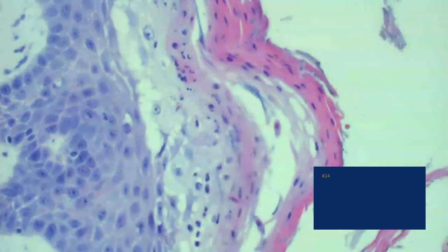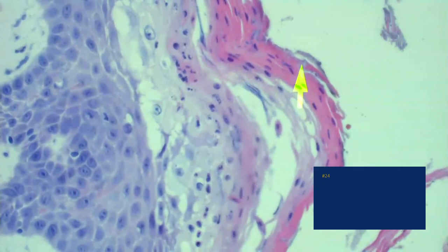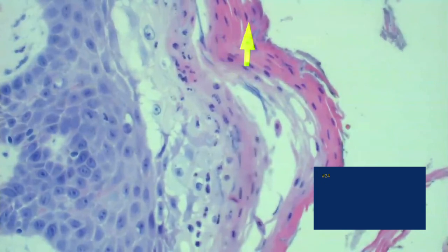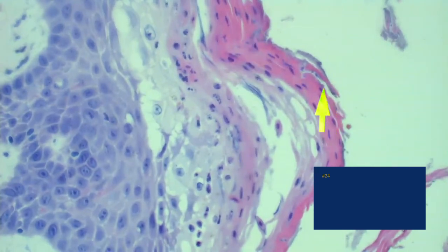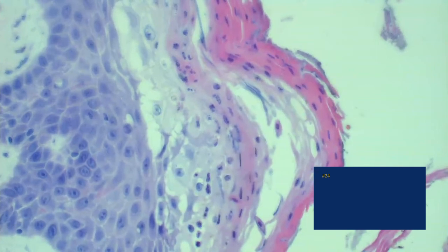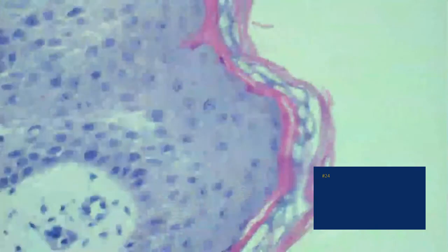So I thought about the sandwich sign as well. I wanted to make sure that there wasn't tinea anywhere. Looks like there actually might be some tinea here. Now, let's say the guy really did have it, does that mean that the tinea here is real as well? Maybe incidental. So this was a kiddo, and maybe they had obvious nutritional deficiencies, acrodermatitis or something like that. They could get a secondary candida. But that shows you, and again, in this case it's called nutritional deficiency.